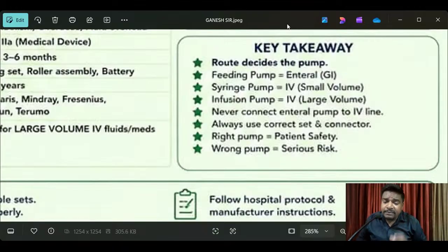Whenever there is a complaint about a patient, the nursing staff, dietitian and doctor will take care and be responsible at the end of the day. We are not. But if the equipment is not working, that comes to us, to biomedical engineers. So if you follow the proper technical way, you will be safe, and you can provide proper instant services to the hospital.